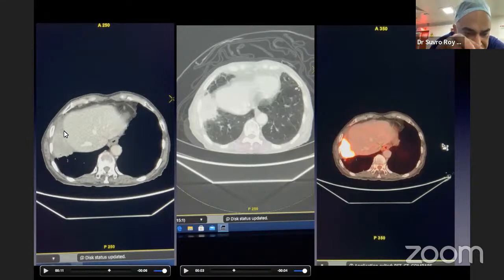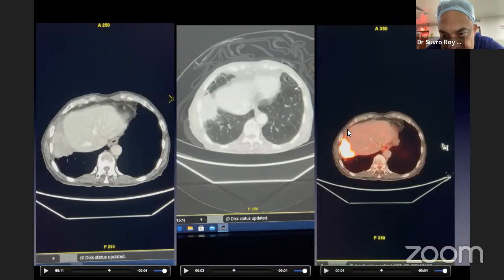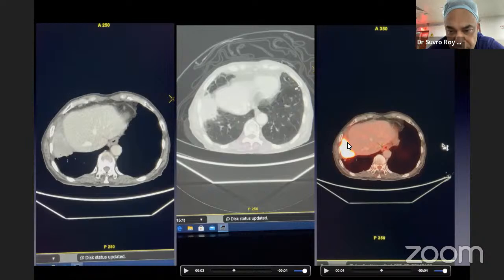Now, in this case, the tumor is more hypervascular than the background obstructive atelectasis. However, and you can actually see it on the PET too. You can see the not avid little triangle of lung tissue, compressed lung tissue, which you cannot appreciate on the lung windows, of course.